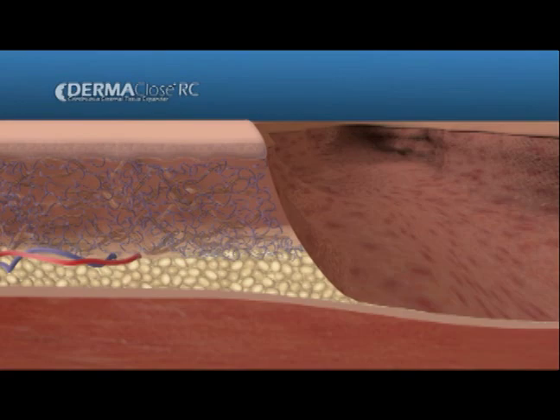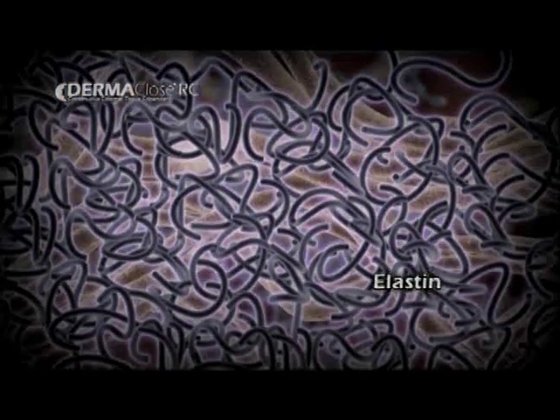Dermaclose is a unique device used to expand tissue adjacent to a wound. Bundles of collagen and elastin are situated in the dermis surrounding the wound.